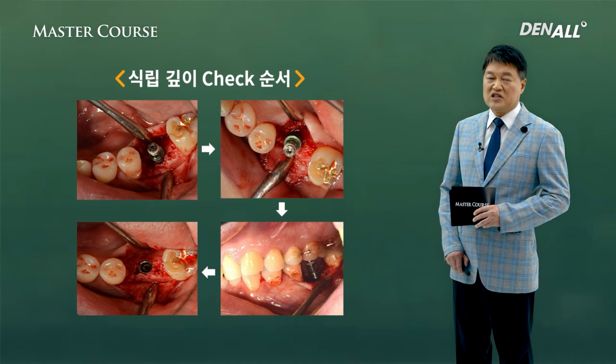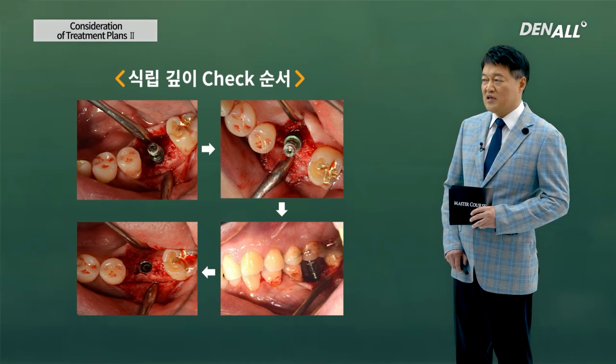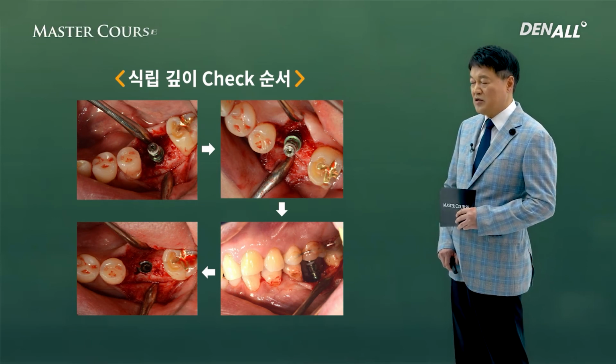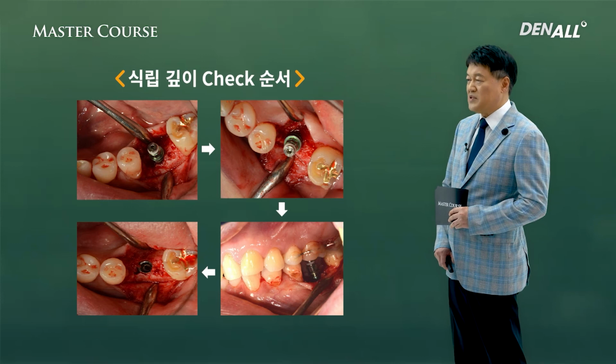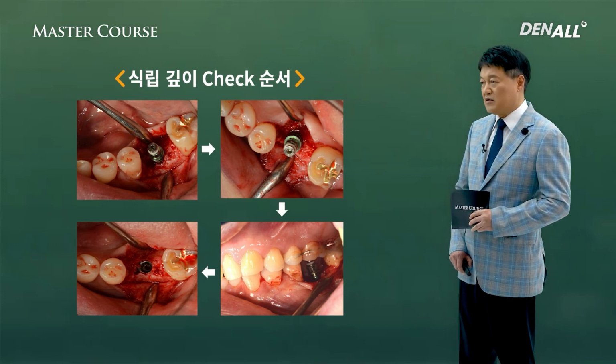After you do placement, on the buccal side, check if the rough surface is positioned below the bone, check the lingual side as well, and also evaluate the occlusion. If the mount goes in smoothly, you need to check if 8 mm space can be secured. If there's a lack of space, you need to place a little more deeply to secure that space.